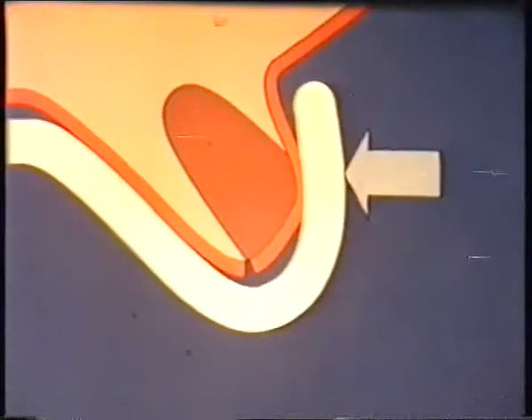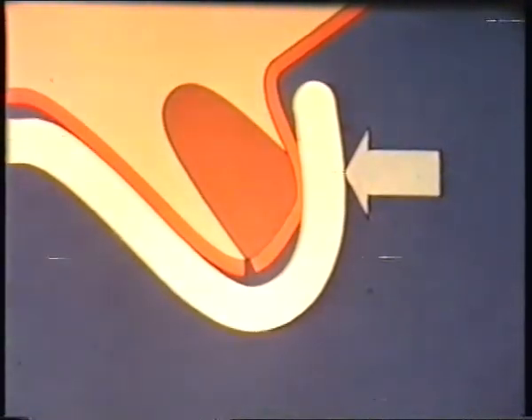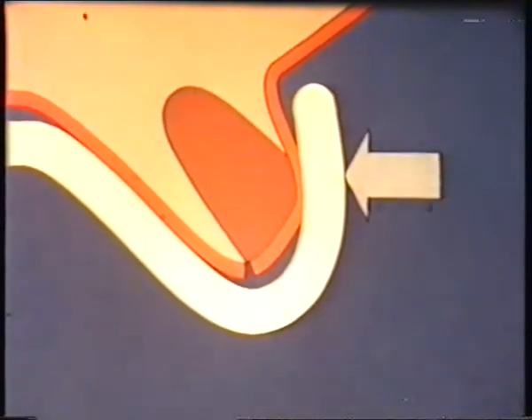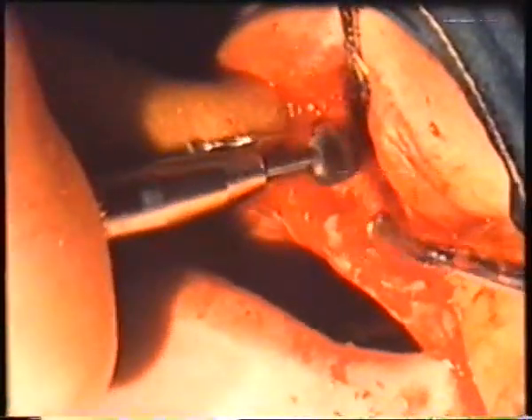Now the clear resin template is fitted to the upper jaw. Any areas that have not been reduced sufficiently to allow the plate to be fitted correctly will be visible through the transparent template as blanched areas of mucosa. If any such areas are noticed, further bone reduction must be carried out.